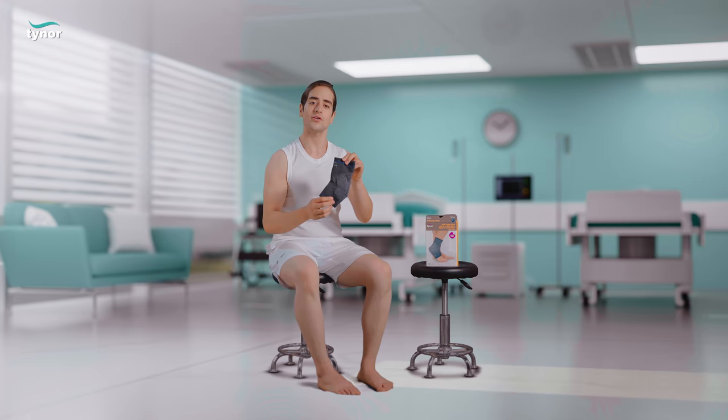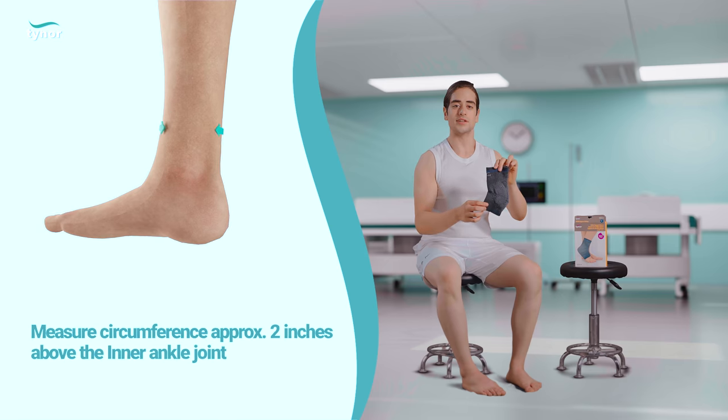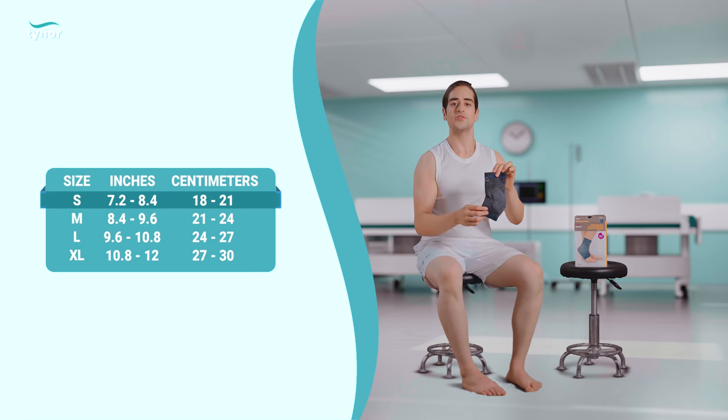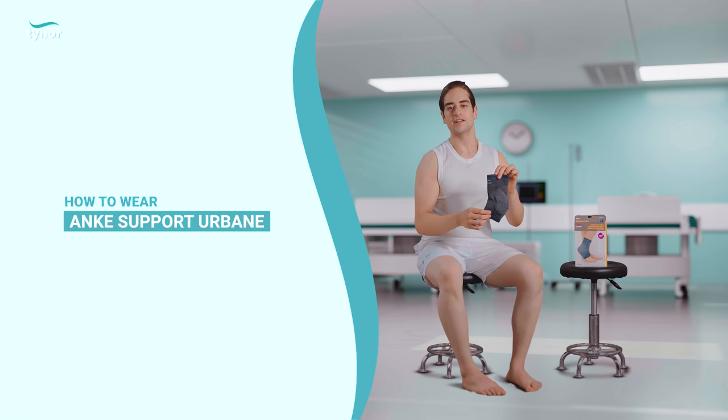Let me now show you how to measure and how to use the ankle support urban. Measure the circumference approximately 2 inches above the inner ankle joint and refer to the size chart printed on the box.